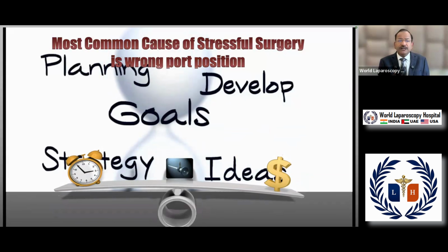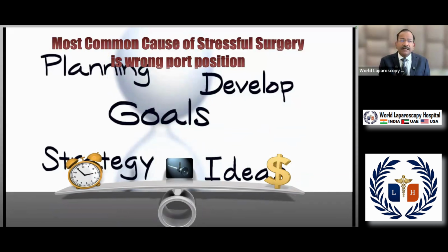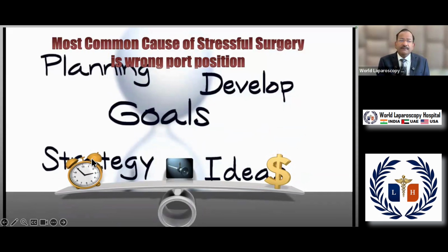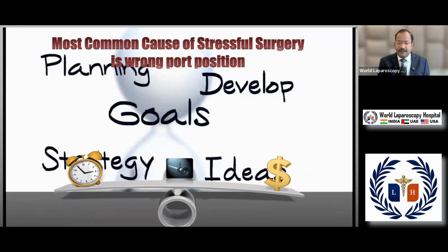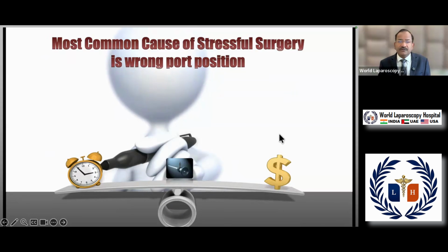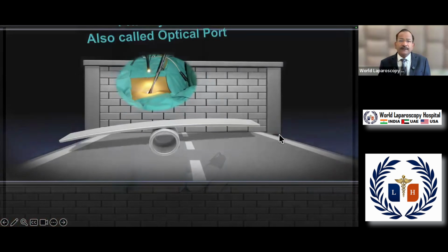If your port position is wrong, your surgery will take a lot of time. The same surgery which you can do within half an hour may take many hours, and it will be more time consuming as well. So, correct port position is important.